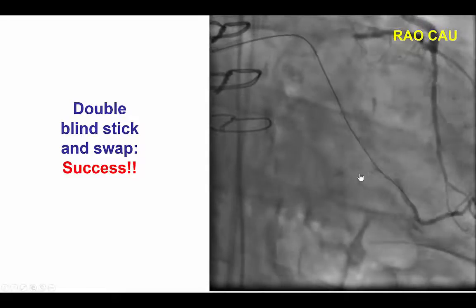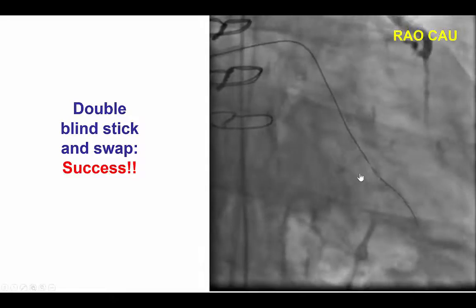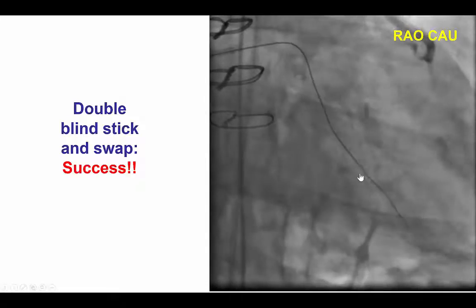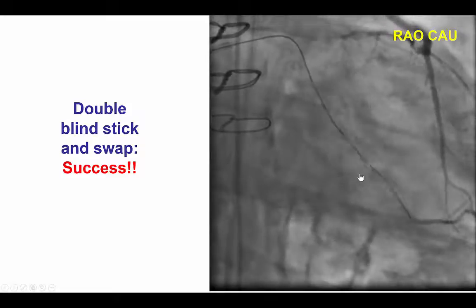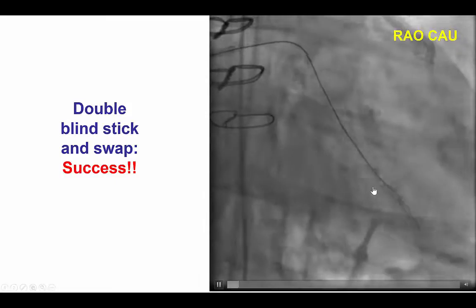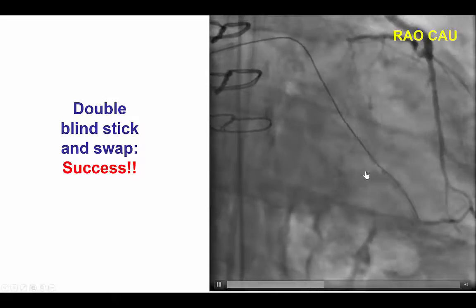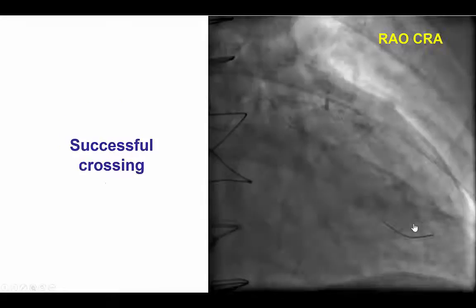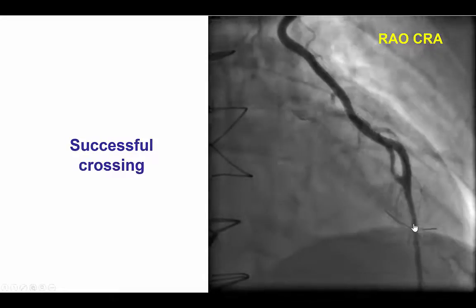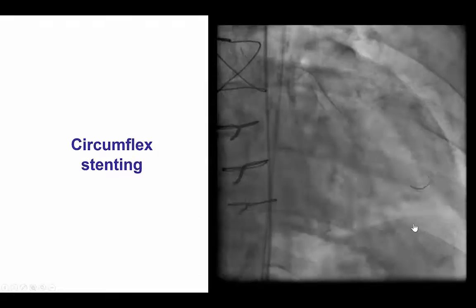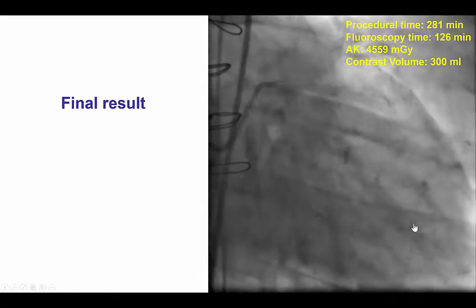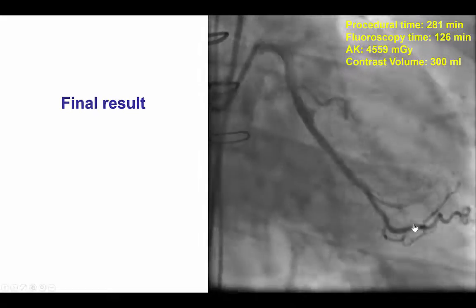We were actually about to give up — it had been several hours into the case — but we decided to do a final attempt using a new Stingray balloon, as the previous one was damaged. This time, we were able to advance a Gaia guide wire into the distal true lumen, confirmed with contralateral injection. We then advanced a workhorse wire and placed stents in the circumflex all the way to the left main, successfully recanalizing the CTO.